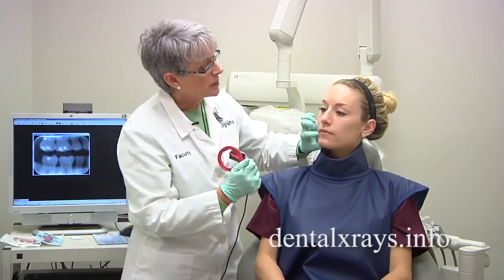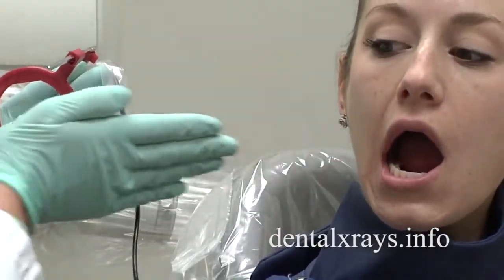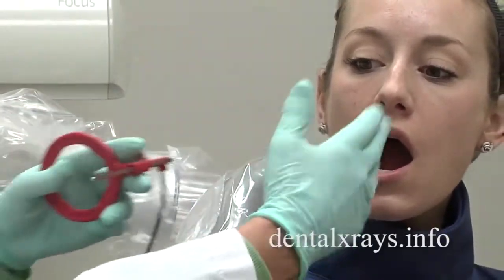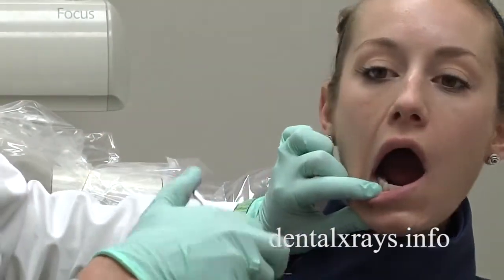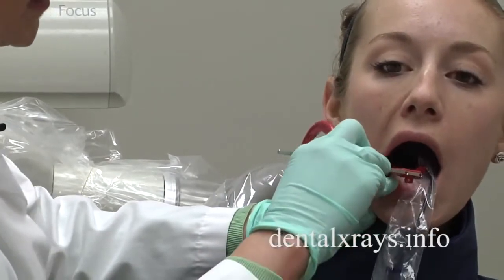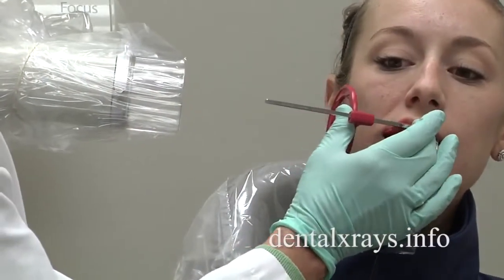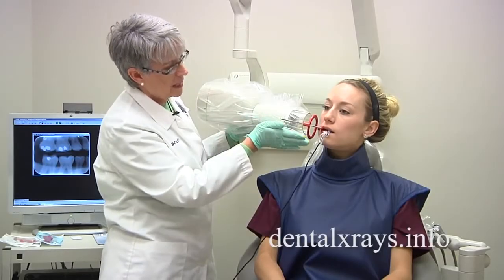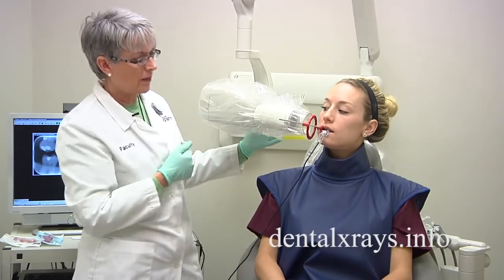What I'm going to do is see where her contacts are coming in. If I want to have this beam coming in to make the contacts open and it's twisted like this, I'm going to have to think outside the circle and bring my cone coming this way. So I'm going to place it in the patient's mouth, twist it so it's a cross arch, have the patient bite down, and rather than coming straight in, I want to come this way — thinking outside the circle and taking the view like this.